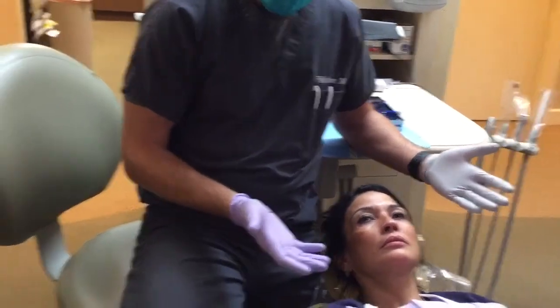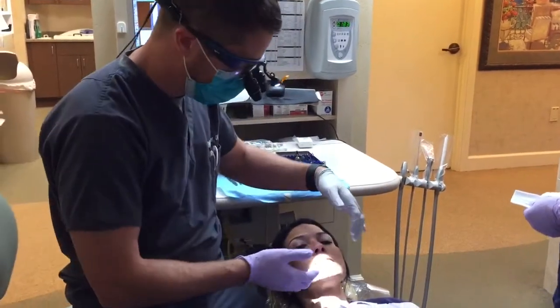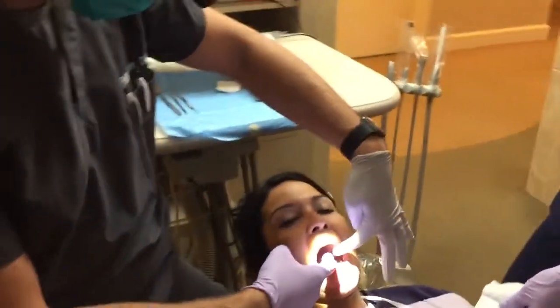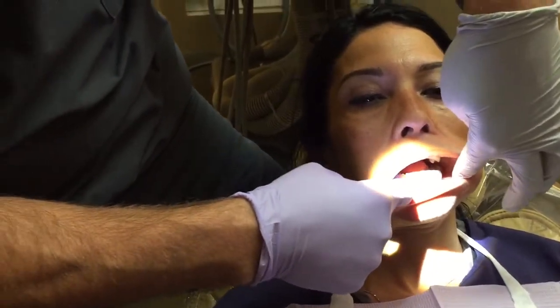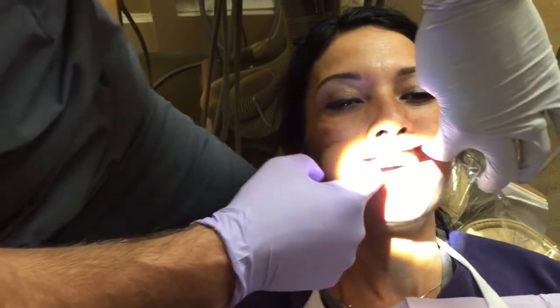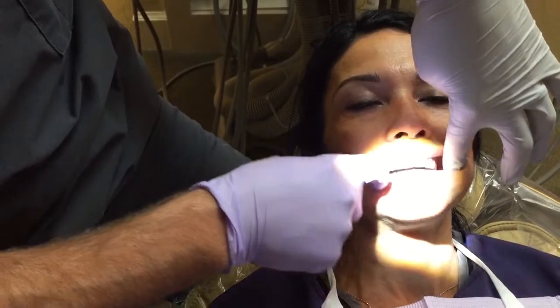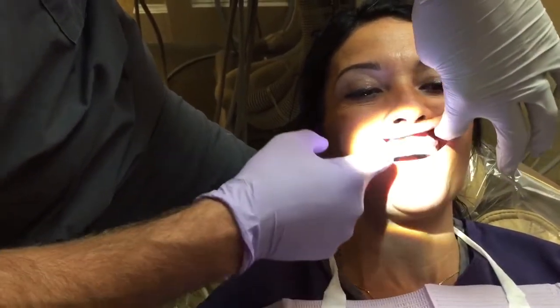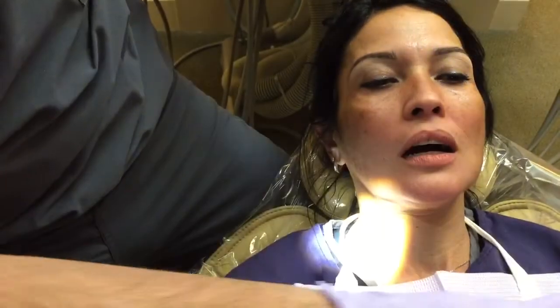Once the jaw joints are assessed, you start looking in the mouth. I put my fingers in the corners of the mouth, make sure the patient is relaxed, and look down the lower lip. Then I pull the upper lip and check the front six lower and upper teeth just to make sure there's nothing going on. That's about as much as you can see with just your fingers.